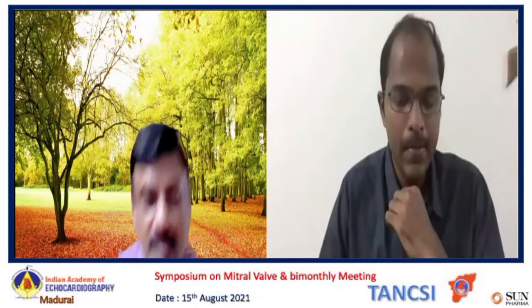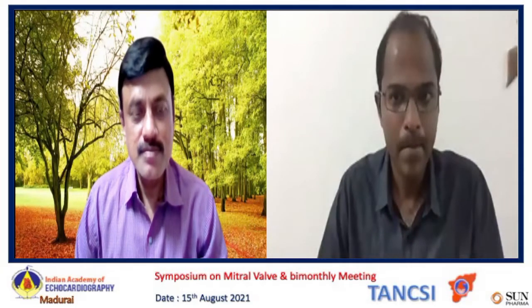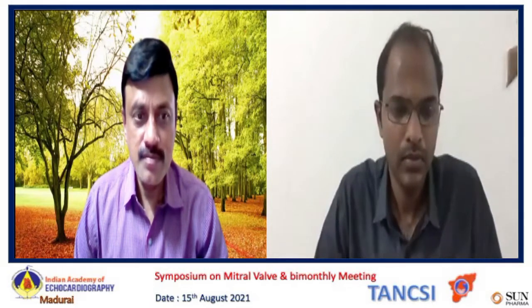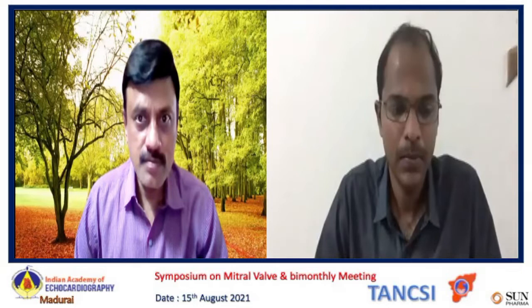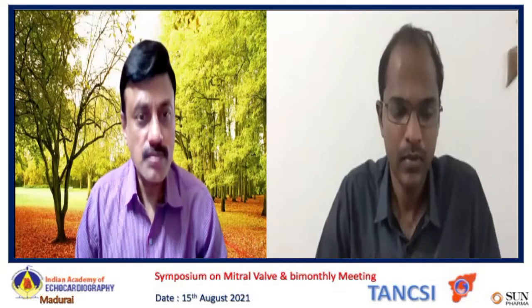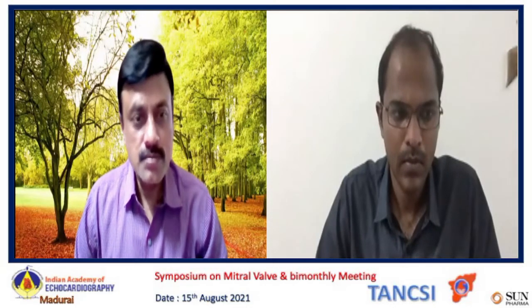Yeah, Kannan, unfortunately, I was not able to see a lot of the images, but one of the things about paravalvular leak assessment is, at the moment you get it on a transesophageal echo, fortunately, now we have the ability to use X-plane imaging, irrespective of whatever 3D machine you're using, where two orthogonal views are displayed. Then you will be able to identify the two different axes of a paravalvular leak. Quite often, the long axis of the leak will be along the circumference, and the short axis of the leak will be perpendicular to the circumference.